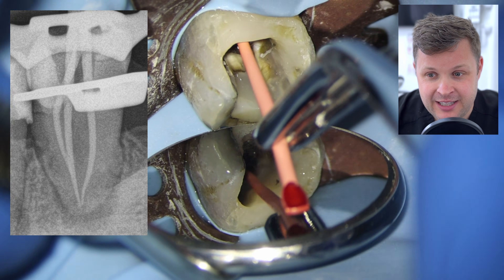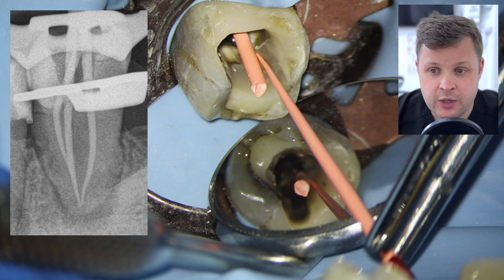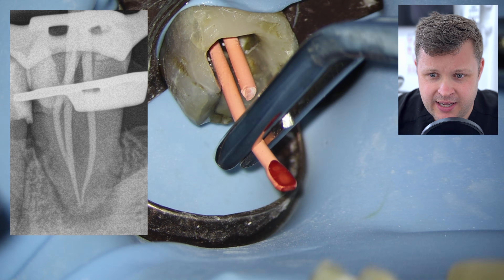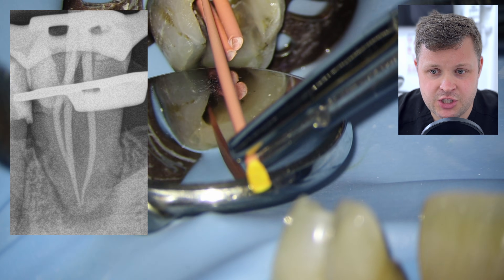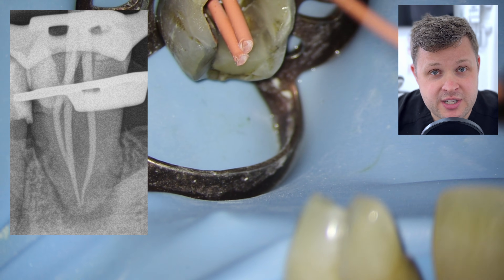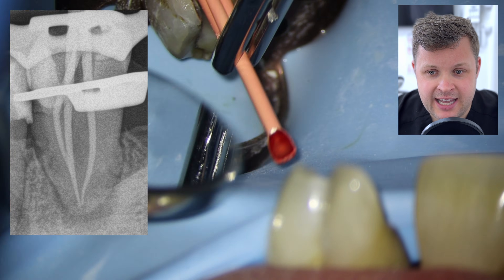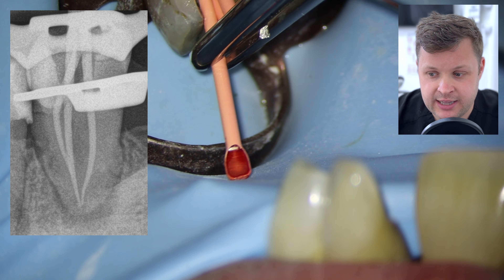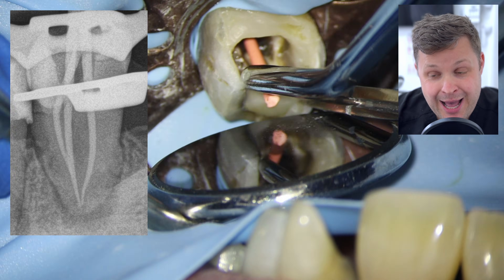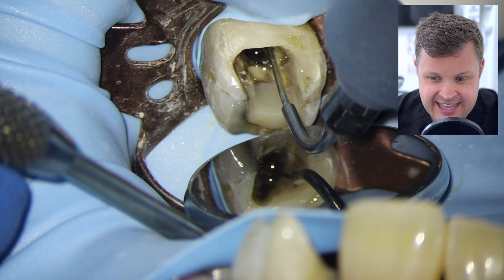Now ready for the cone fit radiograph. I place size 25 matched HyFlex GP cones into the two canals shaped with the size 25 HyFlex. I initially considered a size 20 matched cone for the third canal, but when I placed it to length and pulled it out, it was a little concertina'd at the end. So I tried a size 25 HyFlex GP point — it went to length and the cone fit looks absolutely fantastic, really really nice.